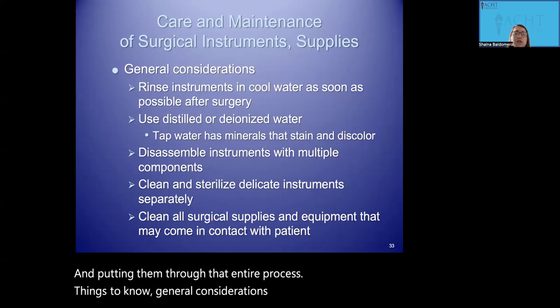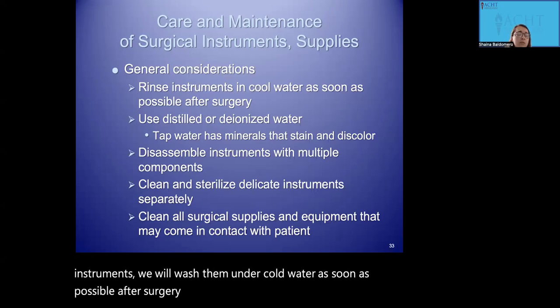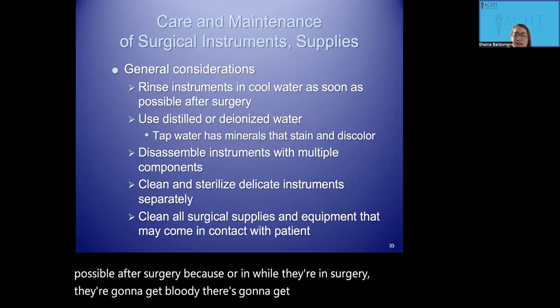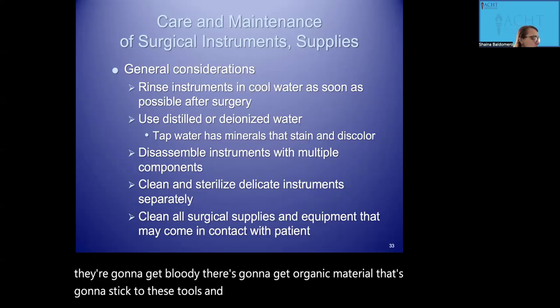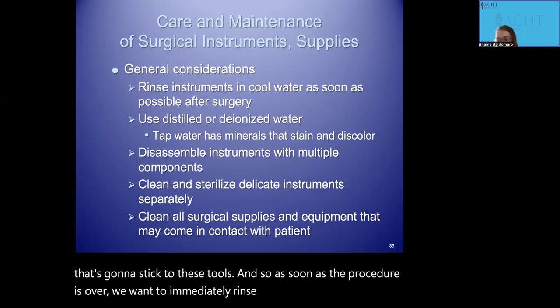Whenever you're rinsing instruments, we will wash them under cold water as soon as possible after surgery, because while they're in surgery, they're going to get bloody, and there's going to be organic material that's going to stick to these tools. And so as soon as the procedure is over, we want to immediately rinse them to start to remove that organic material.